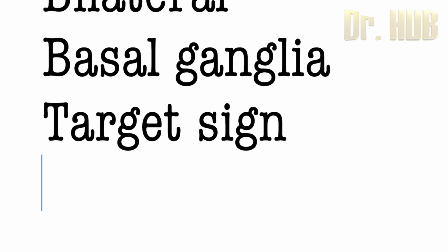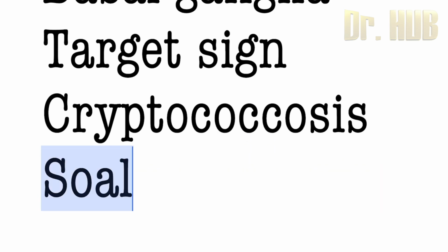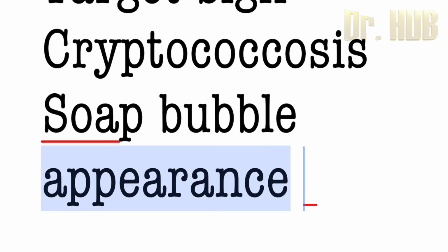Then we look at cryptococcosis. Cryptococcosis has a prominent soap bubble appearance, which is seen.